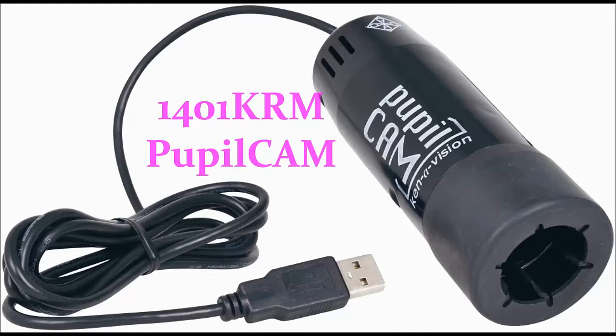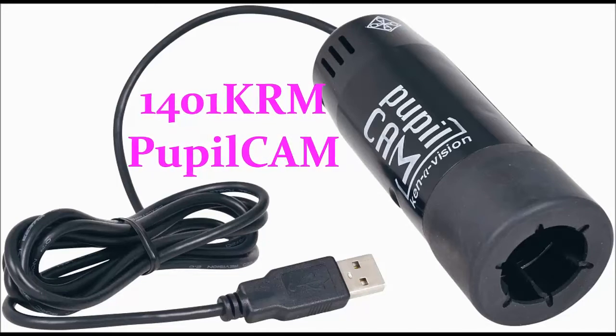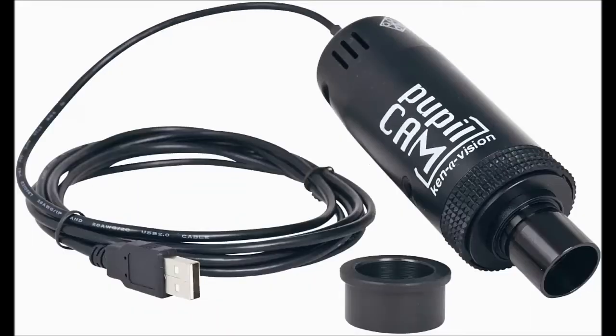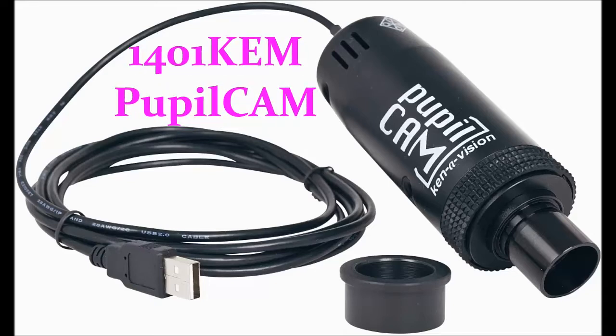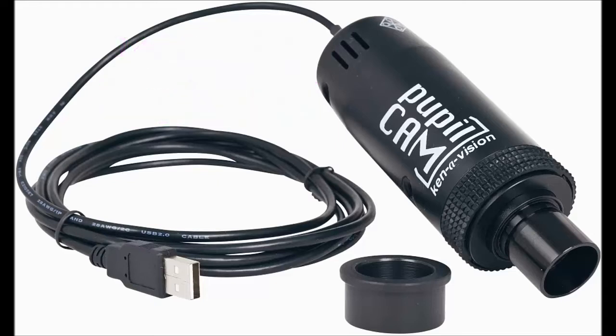The first model is the 1401K-RM PupilCam, which has a rubber eyepiece adapter that allows the user to slide the camera over the eyepiece and body tube of their compound microscope. The second model is the 1401K-EM PupilCam, which has a built-in 10X eyepiece that allows the user to securely and accurately slide the camera into the eyepiece body tube of their compound microscope, or the user can add the eyepiece adapter on the PupilCam to fit on their stereoscope.